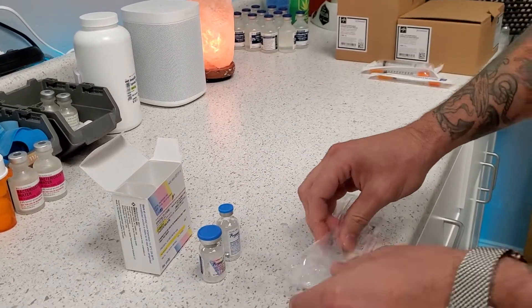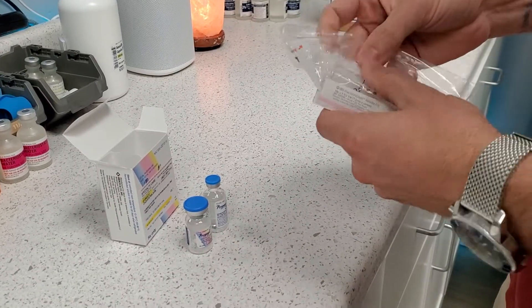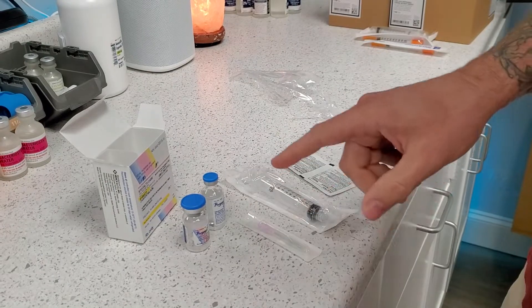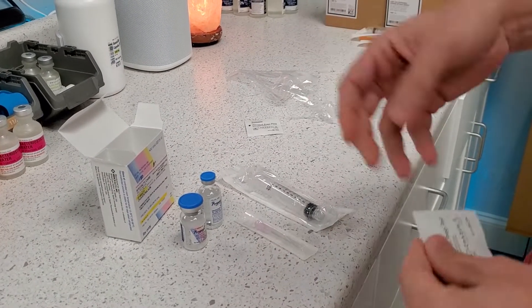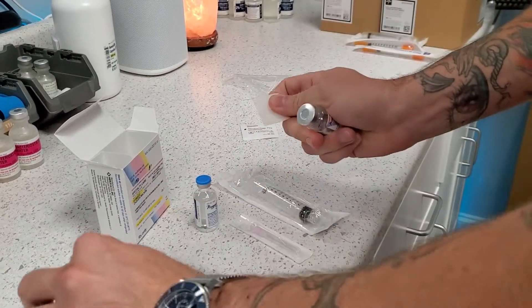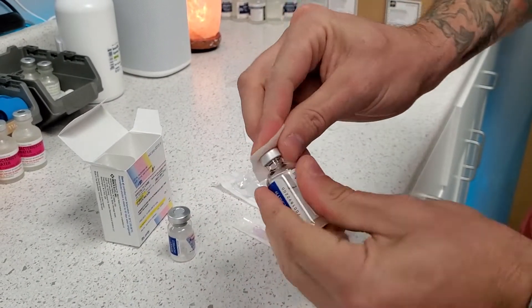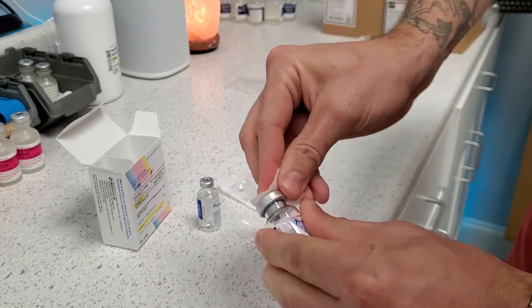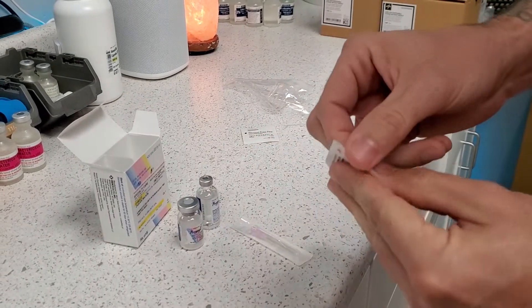The caps on them are just to keep everything sterile, but we're going to wipe them down with alcohol no matter what. We're going to open one of these little alcohol pads up, remove the plastic caps, and then just press and give them a wipe. Same thing here — press and give them a wipe. And then we're going to open our syringe.